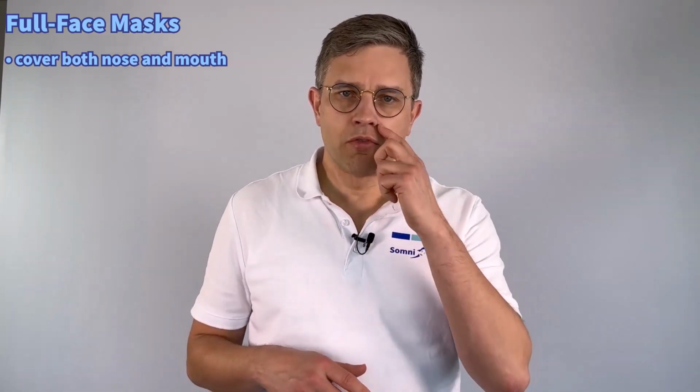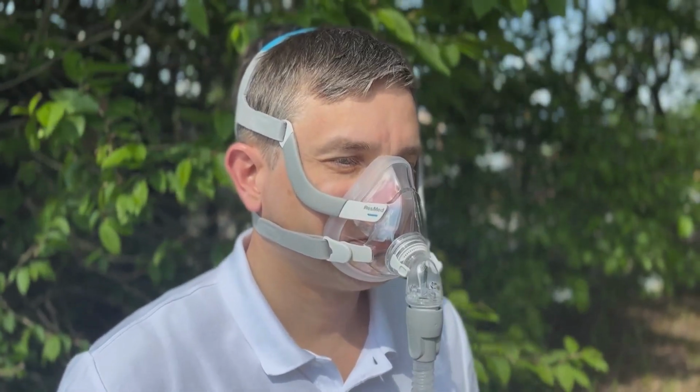The second big category are full face masks. These cover both your nose and your mouth. A common example is the ResMed AirFit F20. Why start with a nasal mask? Most people begin their CPAP therapy with a nasal mask, and that's for three key reasons.